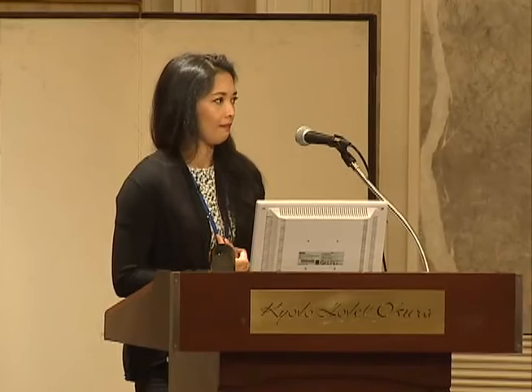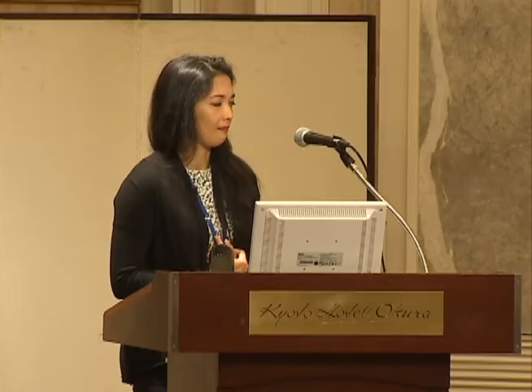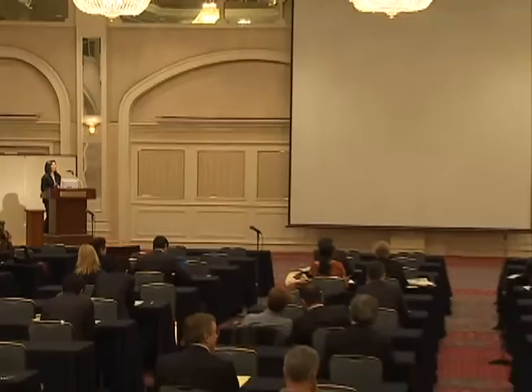So I'd like to ask about the use of OOKP in children. I understand that when your father and your team went to visit Gunther, you had the experience of two children and then they absorbed rather quickly. So what is the experience of the assembled crowd here regarding the OOKP in children? Is it a goer or not a goer? Oh, I think we should go ahead and try to do it, because of course if we don't do anything, then the patient is bound to be amblyopic for the rest of his life. So I think we should be proactive in this case. Yes, something must be done, but what to do is a very, very difficult question to answer. But if it's bilateral, then the amblyopia can be reversed, perhaps. Conrad.